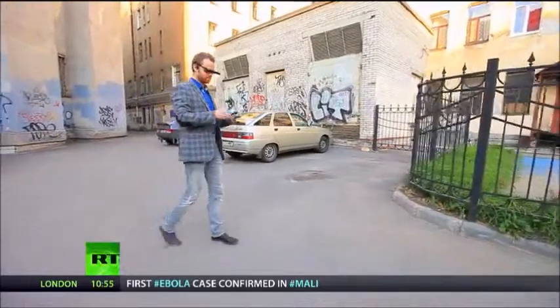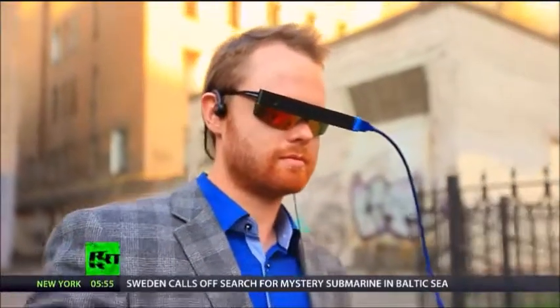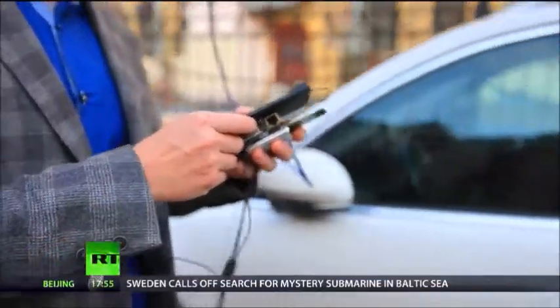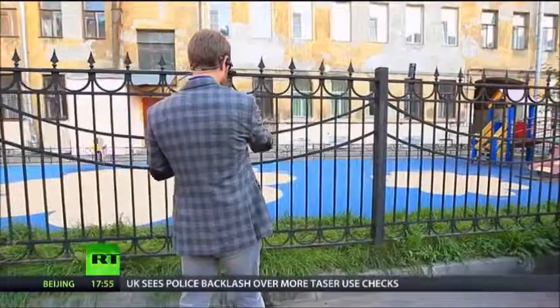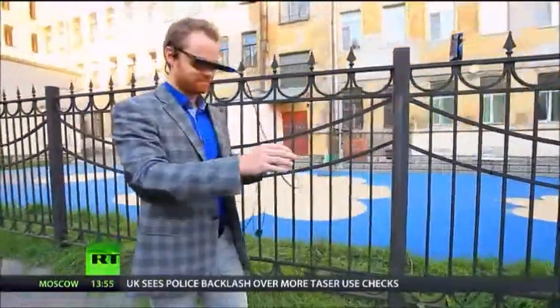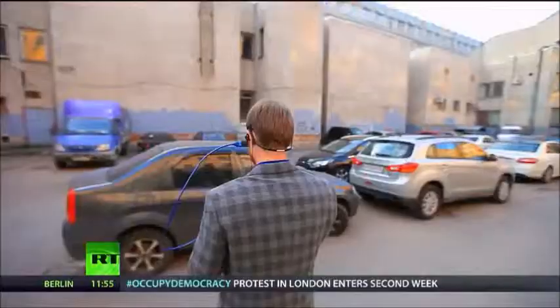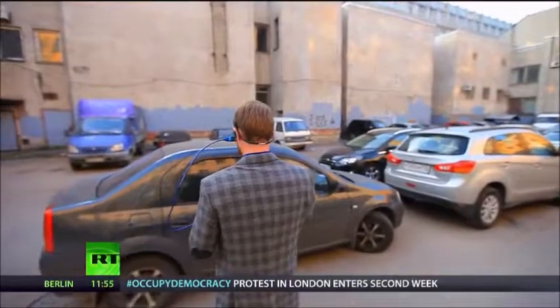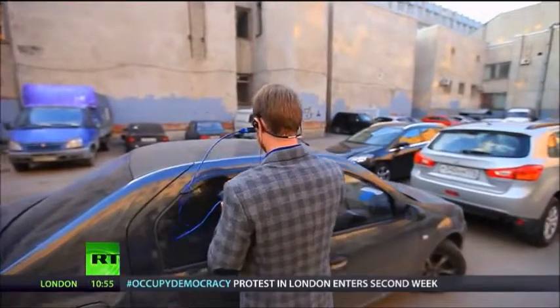Now it was my turn to try the glasses on for size. And so, resisting the temptation to open my eyes and hold my hands out like a zombie, I shuffled slowly forward. Although simply closing my eyes probably doesn't come even close to simulating how a blind person perceives the world, I could appreciate the sense of security Oriense provides, and was even able to locate the position of some of the cars on the car park. But the onlookers didn't seem that impressed.